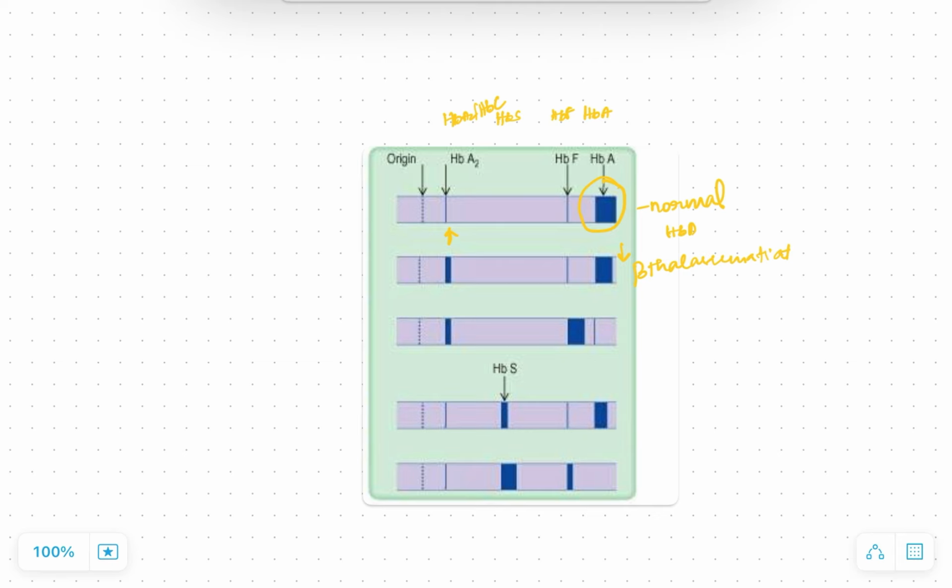And the next question, here we see HbF very much increased and HbA very much decreased, along with HbA2 which is increased. So this is beta thalassemia major. The difference between the trait and the major is that in beta thalassemia trait HbF is almost normal, but in beta thalassemia major we see a very large increase in HbF levels and very much decreased levels of HbA.